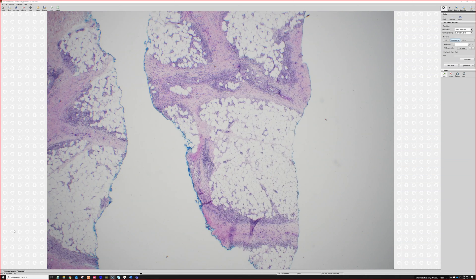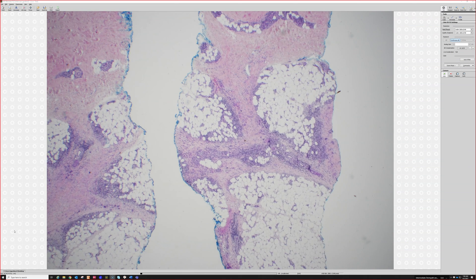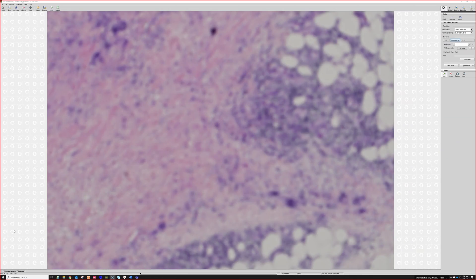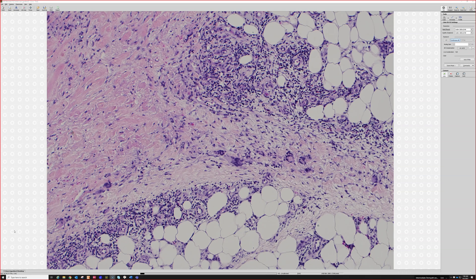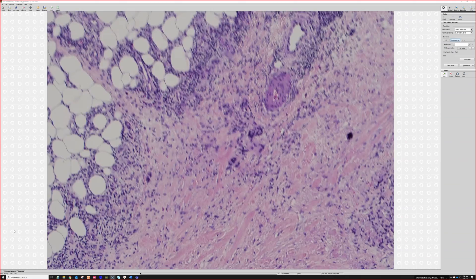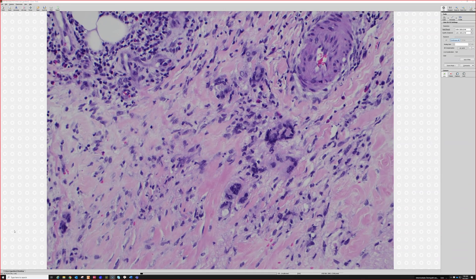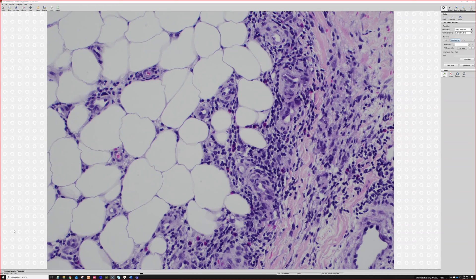Even from low power, the lobularity of the subcutaneous fat is dramatically highlighted because the septal areas are so thickened and widened. When you look closer, and it depends on the stage — early erythema nodosum can be more richly inflammatory and less fibrotic, with some hemorrhage and neutrophils. As it progresses and gets chronic, that turns into fibrosis with granulomatous reactions of histiocytes, sometimes giant cells, eosinophils, and lymphocytes, with a little bit of fat involvement.